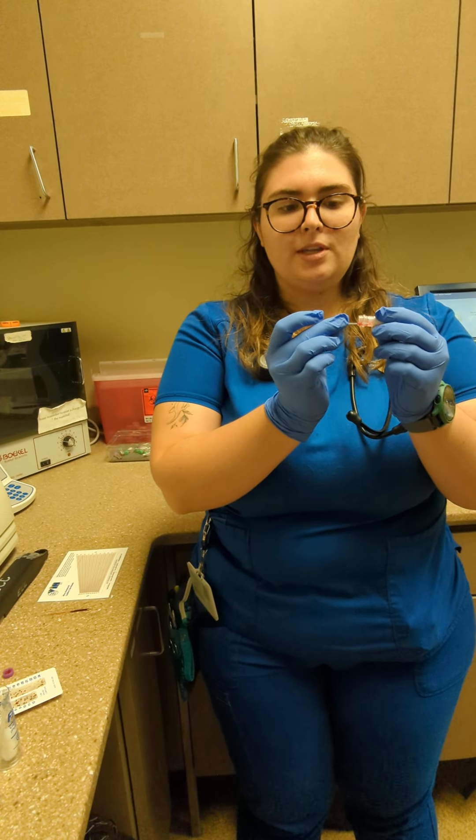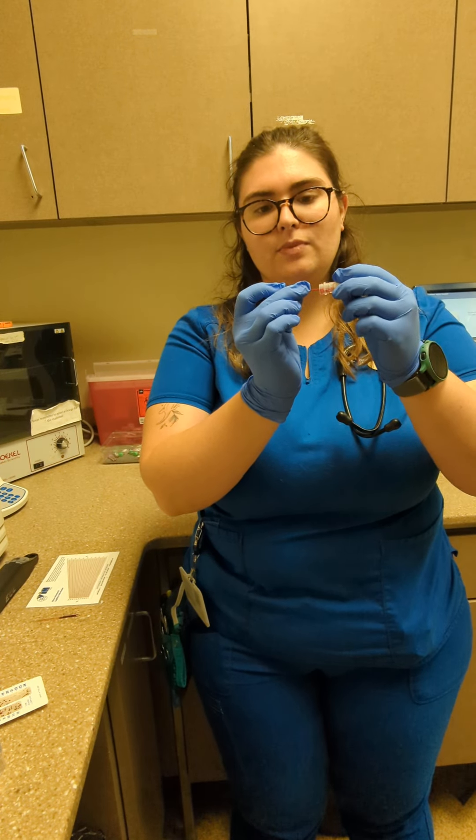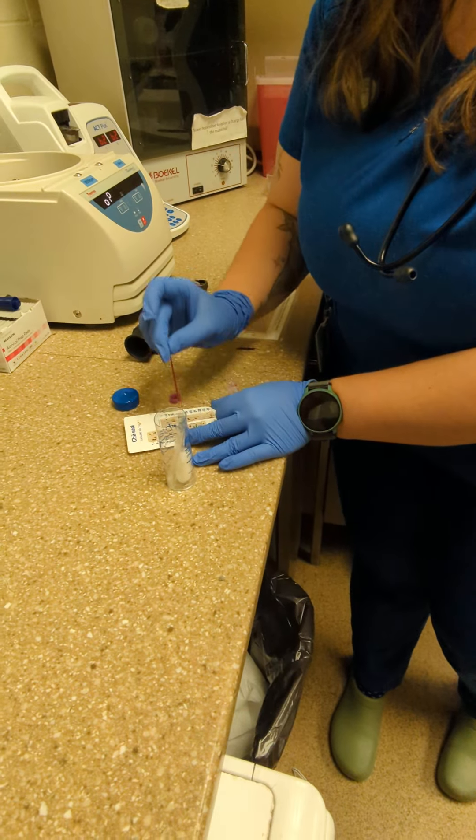Stick it in your blood tube and leave that horizontal, then put up your blood tube. Fill it about 75%, stop it with your finger on the end to keep the blood from falling out, then stick it in your clay a couple times.